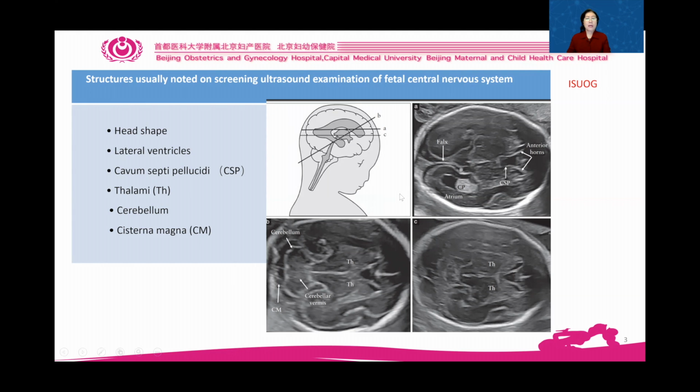Evaluation of the 2 axial planes shows relevant cerebral structures to assess the anatomic integrity of the fetal brain. Usually these are the transventricular and the transcerebellar planes. The third one is the so-called transthalamic plane, which is frequently used.